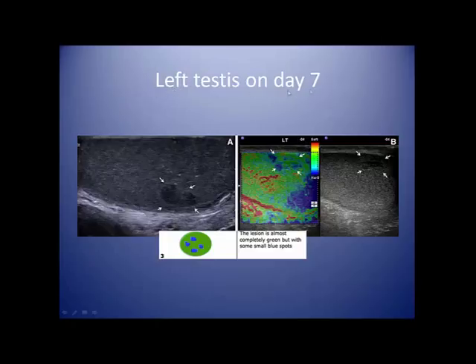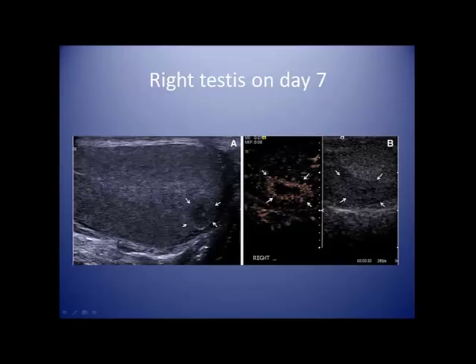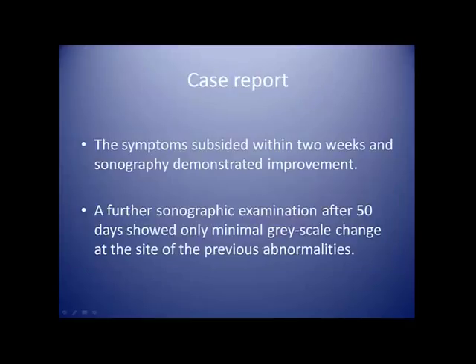Left testis re-scanned on day 7: the lesion is getting smaller, now almost completely green with some blue spots — still a soft lesion. Right testis on day 7: contrast administered, no internal vascularity, and the area which is hypo- to isoechoic on B-mode is enhancing, in keeping with a rim around the lesion. Symptoms subsided within 2 weeks and sonography demonstrated improvement. A further sonographic examination after 50 days showed only minimal grayscale change at the site of the previous abnormalities.